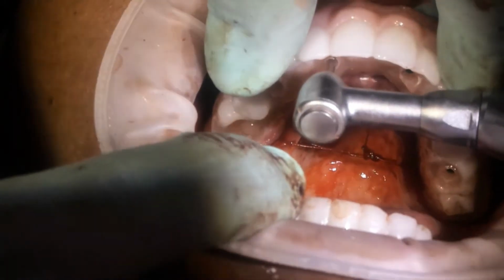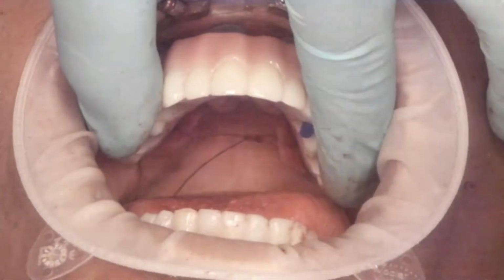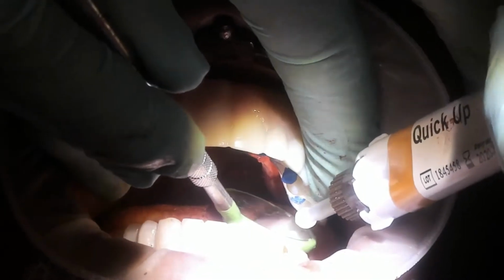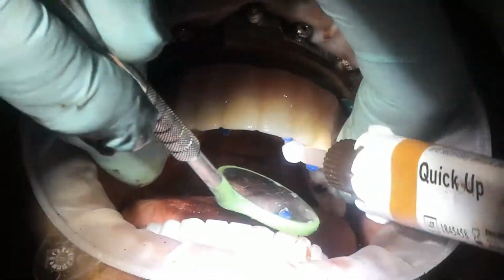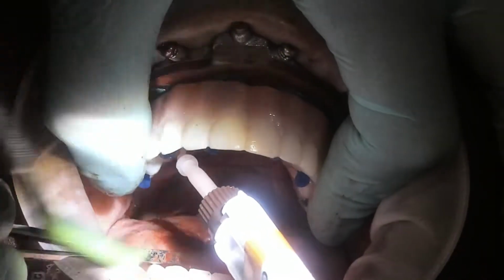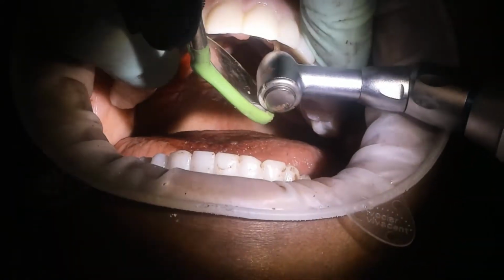Then the prosthetic is removed, and in this particular case, the doctor opted for an aesthetic rapid appliance, which means a duplicate of the long-term prosthetic is printed, and we add pink to the labial. It's an aesthetic rapid appliance that the patient can wear on an ultra short-term basis while we're fabricating the final restorations. So as you can see here, there's a second pickup process. It's optional, but we do recommend it on every case so that you have an exact duplicate as a backup while the patient is going through the healing phase.